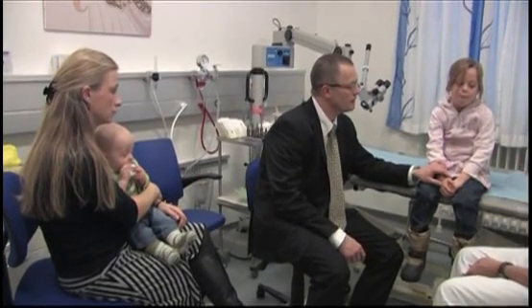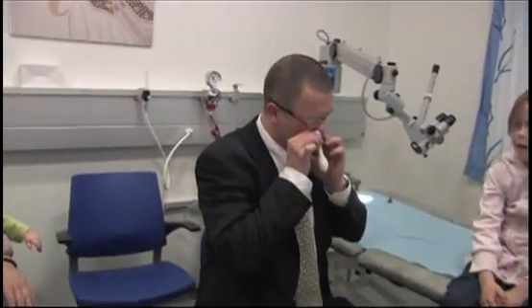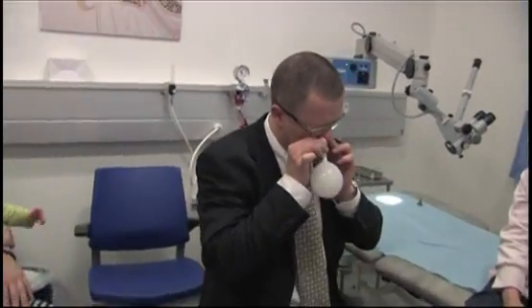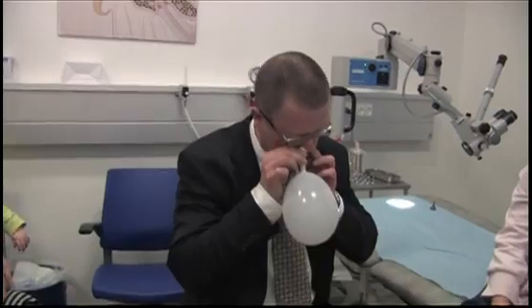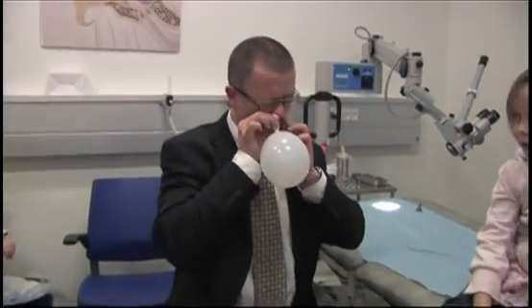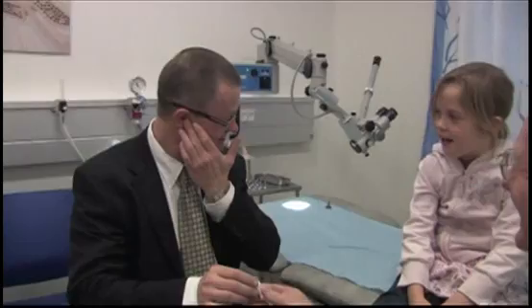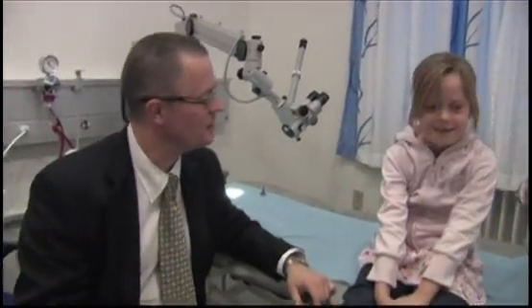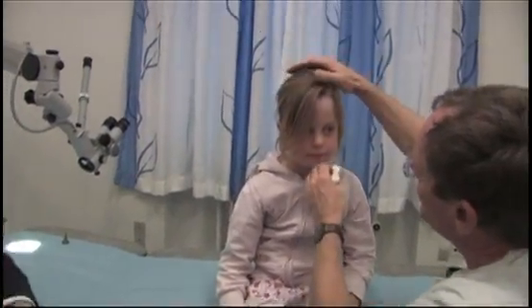To get good compliance with the treatment, it is a good idea to let one of the parents do the first inflation. This makes the next inflation easier for the child, and the parent experiences how the treatment works and feels. The child can see that it is not dangerous to inflate the balloon.